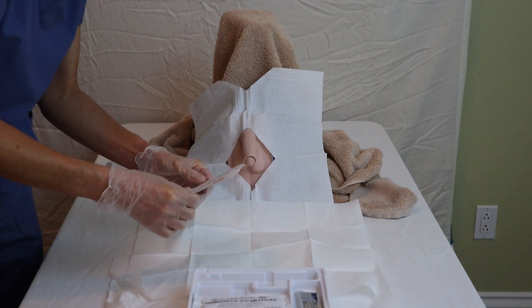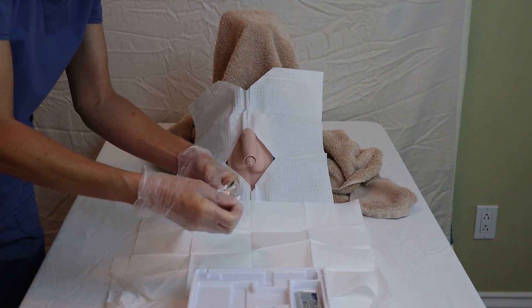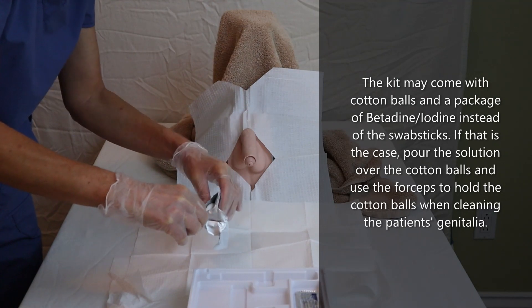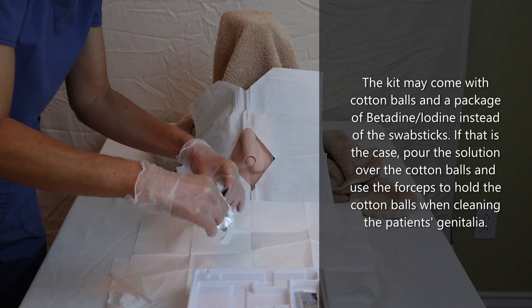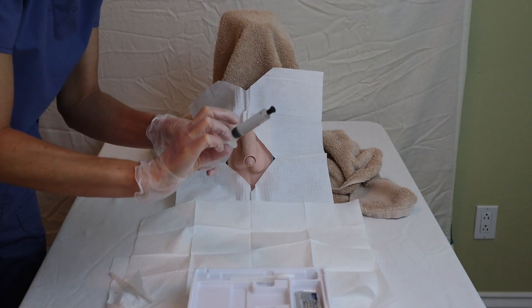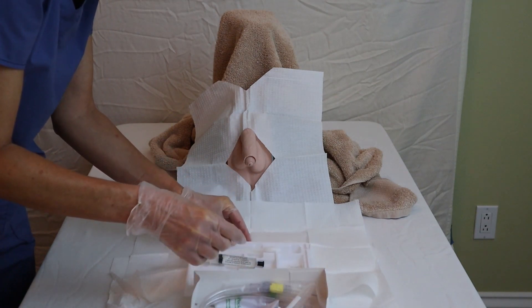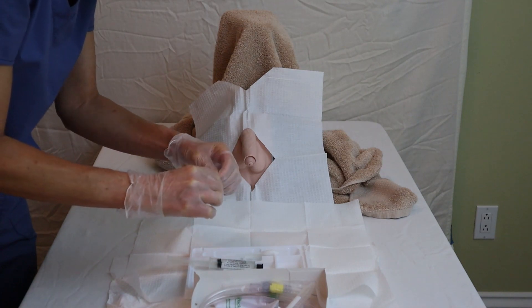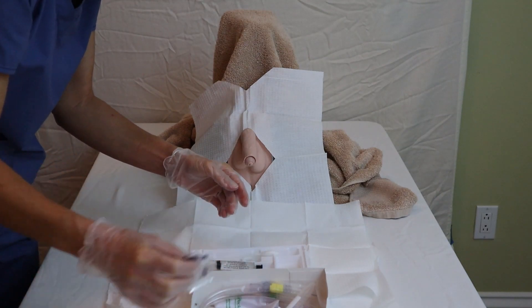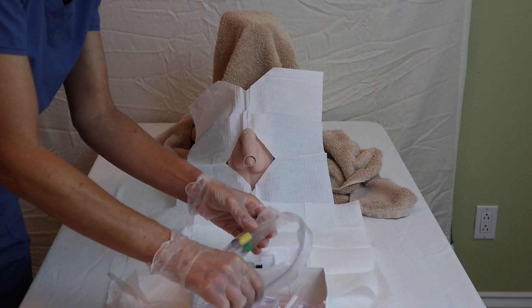These right here are the swab sticks. This particular kit comes with two — I'm only going to use one — and I like to open them up and take them out of the wrapper so that later, when my non-dominant hand is contaminated by touching the patient, I don't have to mess around with the wrapper; they will be easily accessible. The kit also comes with a pre-filled 10 ml syringe as well as some lubricant, so I can now take the tray and place it onto my sterile tray.